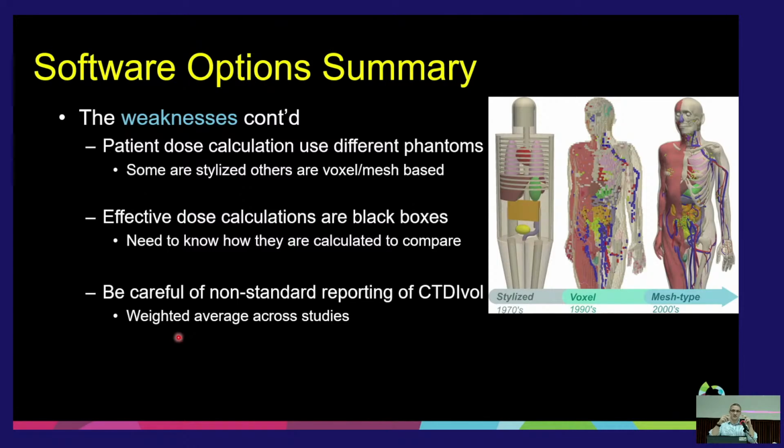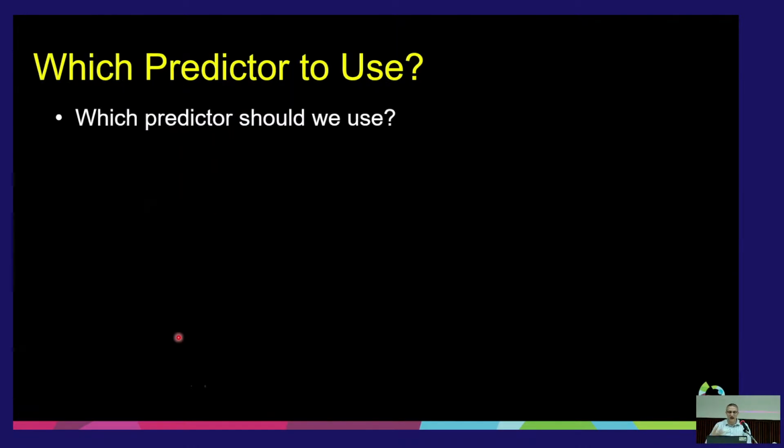And so instead of showing you the 3 individual CTDIs, they'll give you only one value, and that value may be a little higher or lower than what's listed. And so it's not quite appropriate in that regard. And the other thing is, if you have, say, 2 scans under one accession number, then oftentimes they'll just combine them, and it'll just be a very high number. So you need to ask them how they handle those very unique cases.